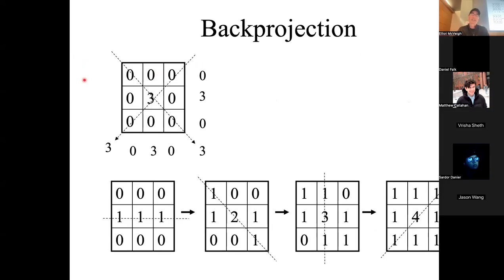Can do it here and say, okay, this G value is this plus this plus this. So it's 0. Okay. This G value is this plus this plus this. It's 3. Okay. This one is 0, etc. I go this way, 0, 3, 0. So I can make all of these measurements in this 3 by 3 matrix.